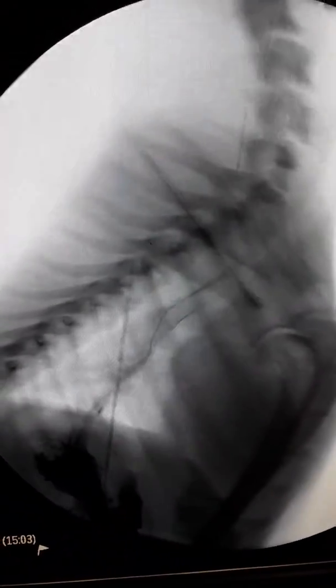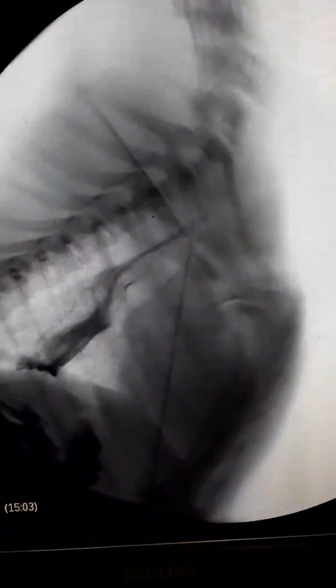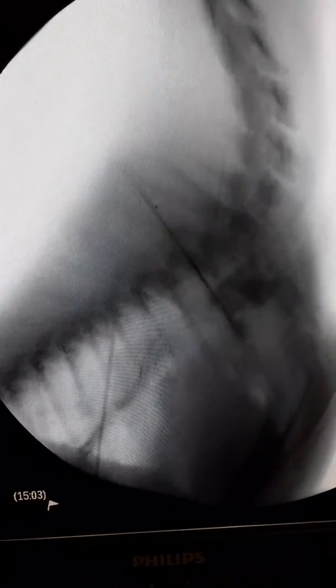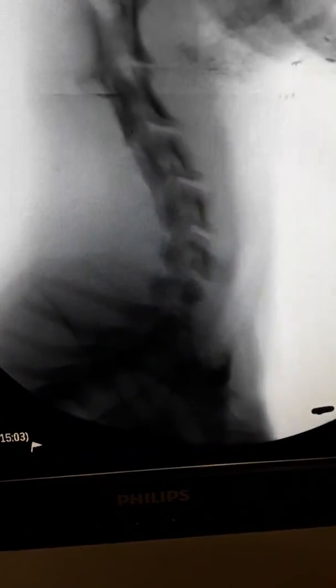Right there, we just caught it moving down — this was probably 30 seconds or a minute after she had swallowed it. There it goes, that lower esophageal sphincter opening to let material through. You can see some material kind of hung up here, still sloshing about a bit, not moving quite normally through the esophagus.